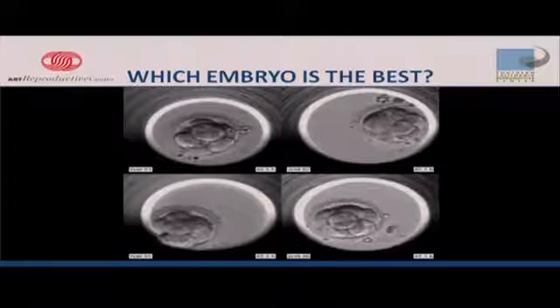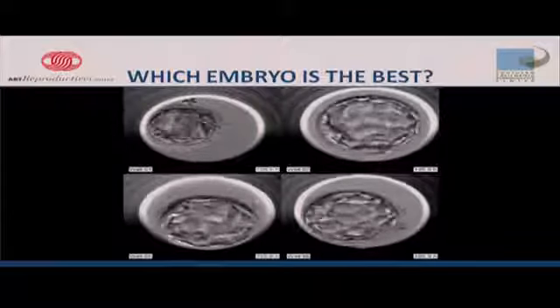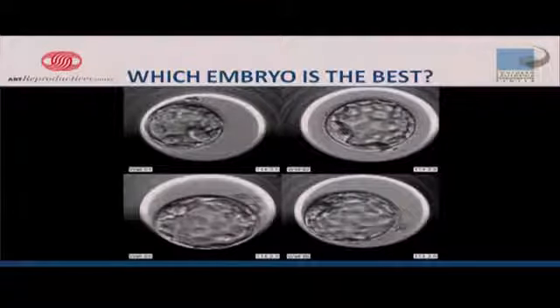So it goes along. And then I'm going to speed up the video because I don't want to take forever with it. And you see them developing along, some form of morula before the others. They keep all expanding. So everybody formed a blastocyst.